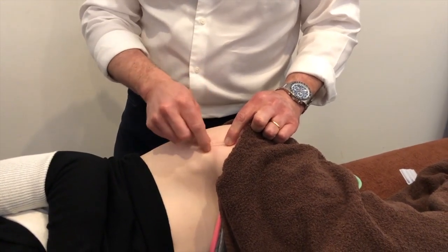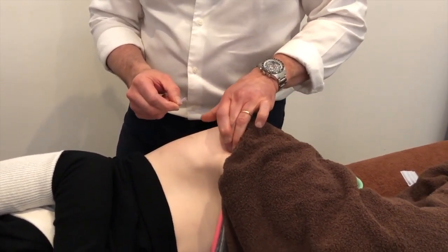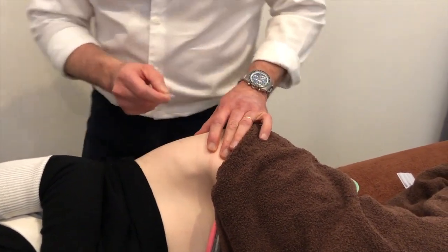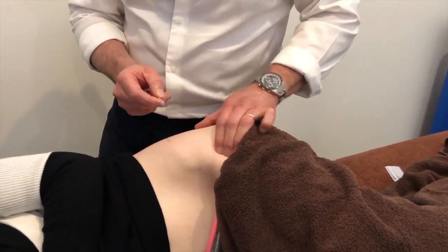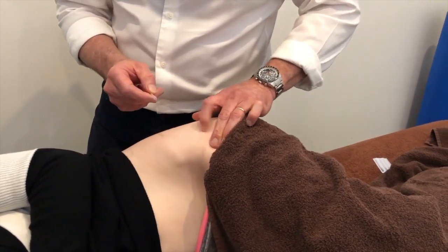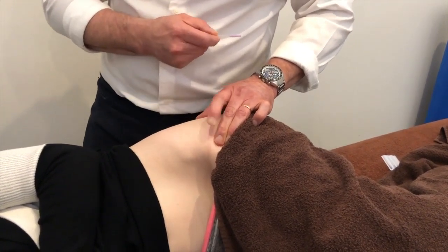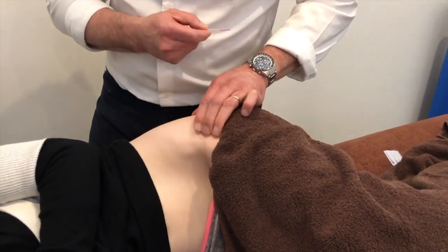Now, once we've got that spot, we put our 3 fingers right over it. It's always the middle finger that's worse, right there. And when we find that spot here, we're going to spread with the fingers here. Important to remember this because if we don't do this, if we just have this and we're feeling like a lot of people do like this, we can end up anywhere. Even if you started here and then you feel with this finger, that finger is over here now, you're going to needle there, you've got a nice big bulge there. That's a problem already.